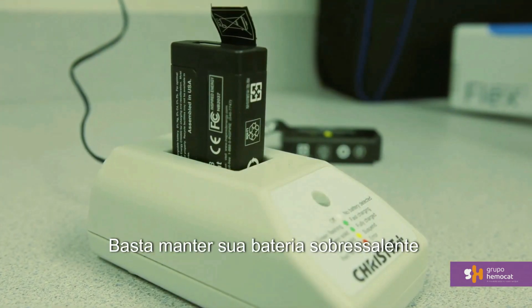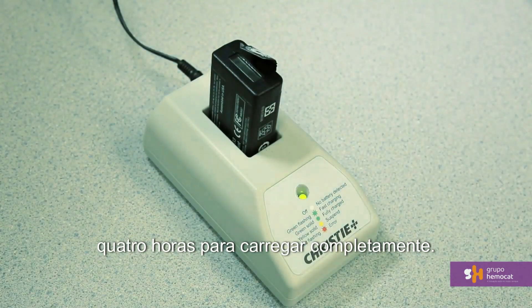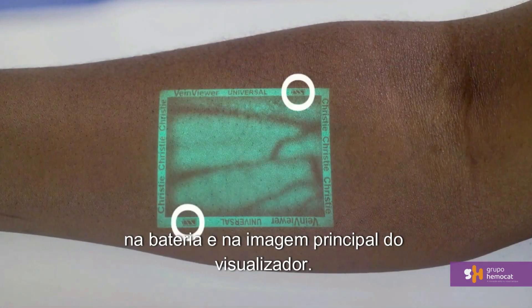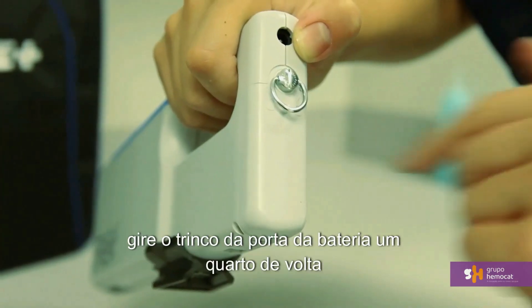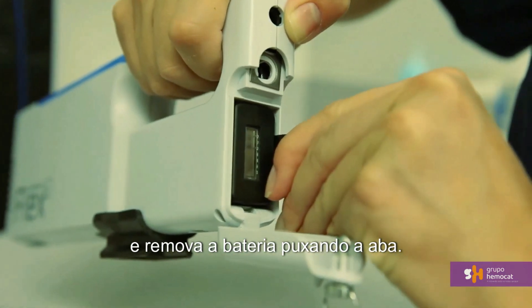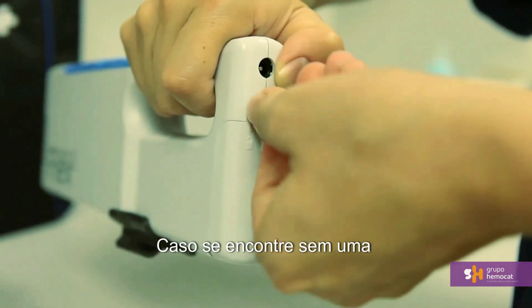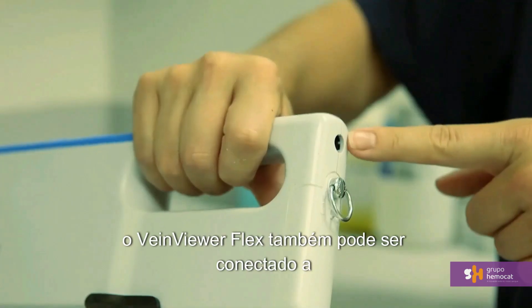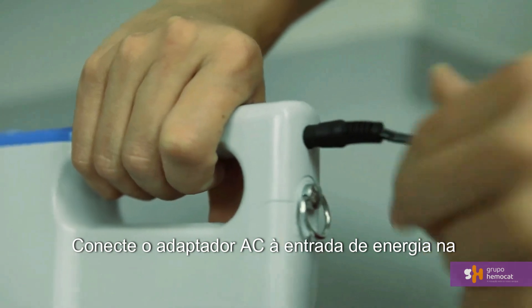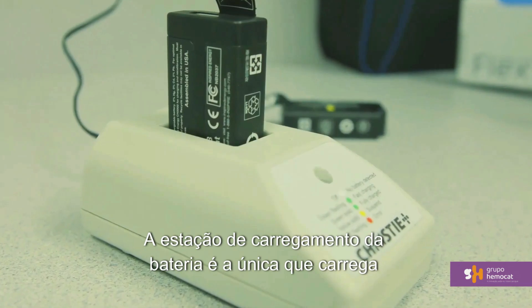Simply keep your spare battery docked in the battery charger and you're ready to go. The Flex battery will need approximately 4 hours to charge completely. Battery level indicators are present on the battery and within the VeinViewer image. To change the Flex battery, turn the battery door latch one quarter turn to the left to unlock the door, and remove the battery by pulling on the tab. Insert the new battery, making sure that the grooves align, and push the battery in until it clicks into place. Should you find yourself without a charged battery, Flex can also be plugged into an electrical outlet via the AC adapter. Connect the AC adapter to the power inlet on the back of the device. Note that the AC adapter does not charge the battery — only the battery charge station will charge the battery.